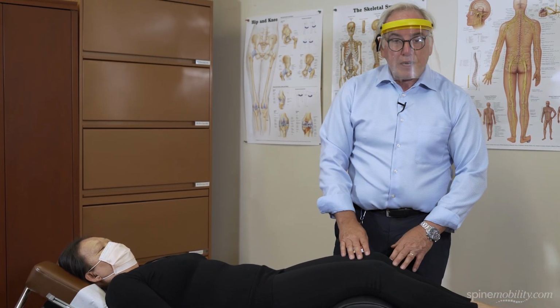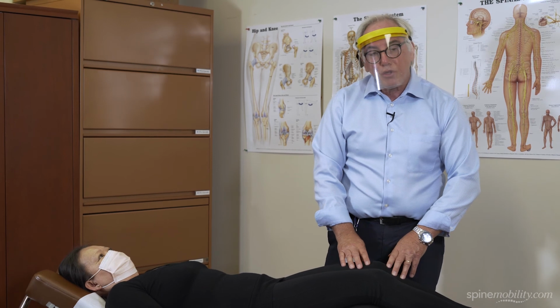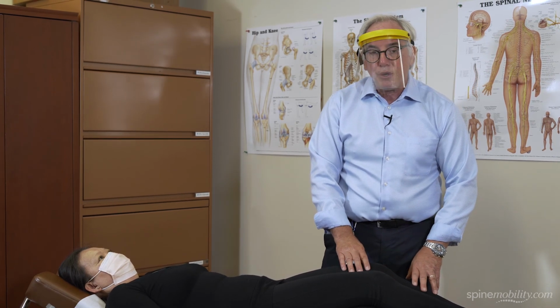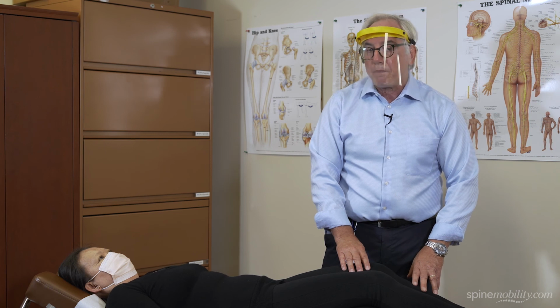Now we're going to demonstrate how the bolster can be used to perform some of the specific exercises outlined for the spinal stenosis and the persistent low back pain protocols.